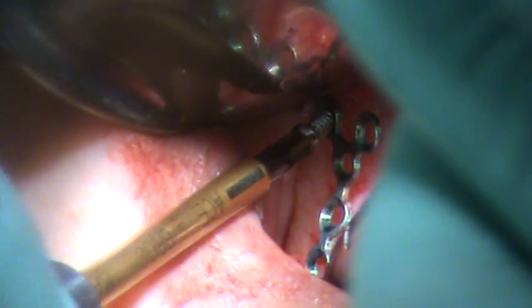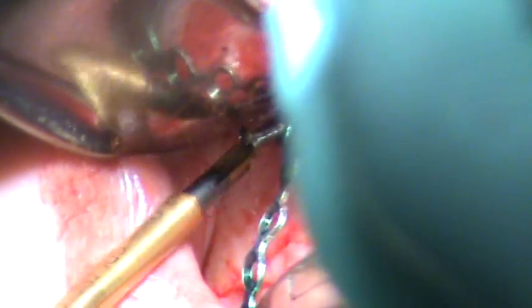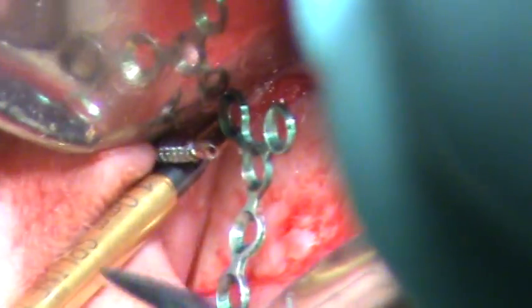The point is that it is very dry. Good. Let's maybe back this way, okay? It's good. It's good.